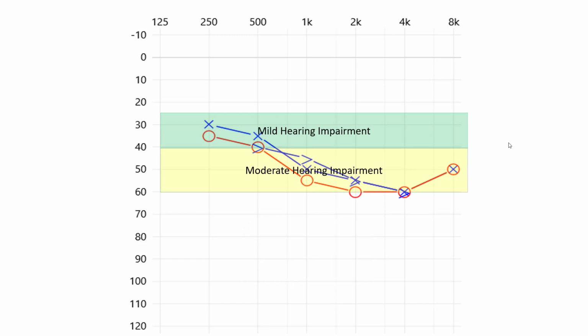But you may be already able to imagine that in cases like that, when we test via the bone conductor, the results are much better. That is, the inner ear is fine, is not damaged, and so when we send a vibration through to those parts of the ear, the results actually look quite good. When we test through the headphone or earphone, the results look poorer. And that difference between the bone conducted measure and the complete system measure, I should say, indicates to us that the patient has a conductive pathology, a pathology in the outer or middle ear somewhere. Let's look at an example.